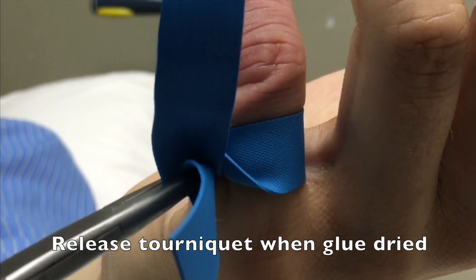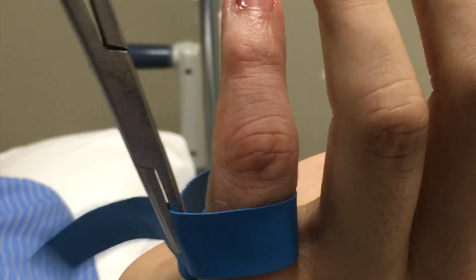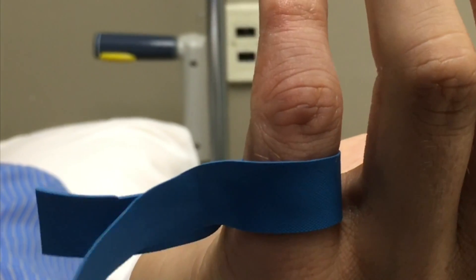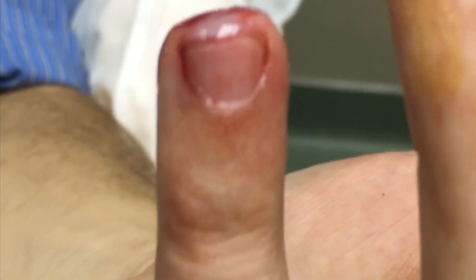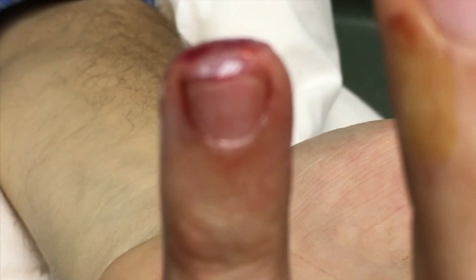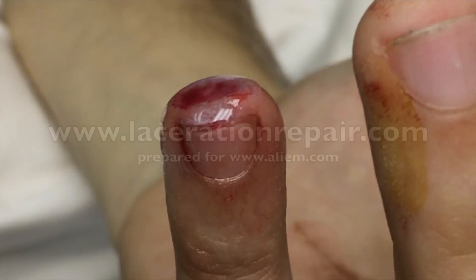Finally, once the glue is dried, you can release the tourniquet from the wound — simply by unwinding the needle driver and releasing the tourniquet. At this point, you should have a completely hemostatic seal over the wound, as you see here. As with all applications of tissue adhesive glue, it will remain present for about five days, will naturally slough off, and you will have created a completely hemostatic wound cover for the initial stages of healing.